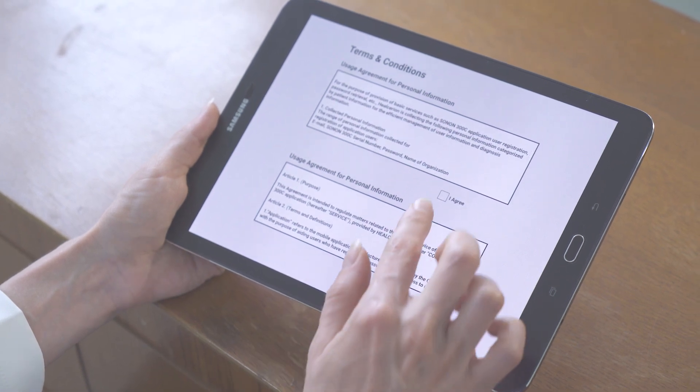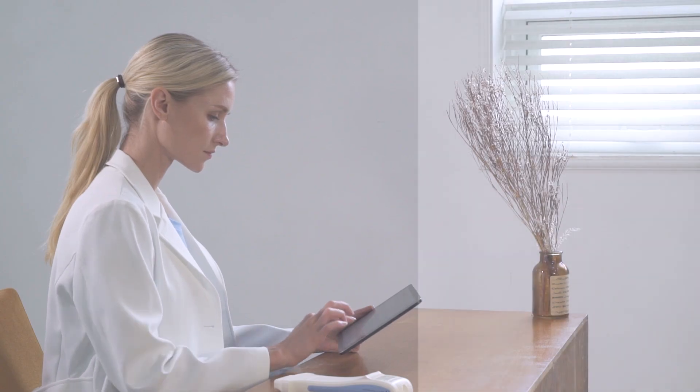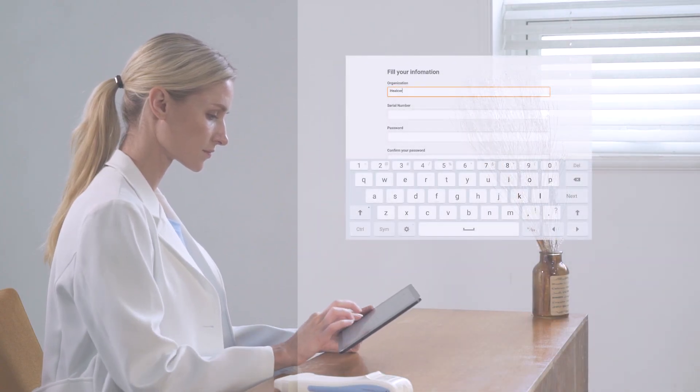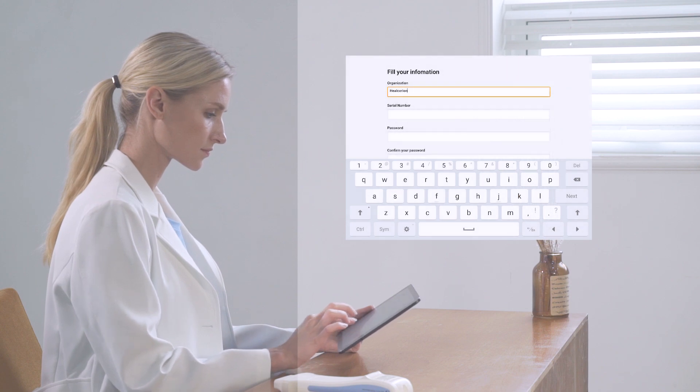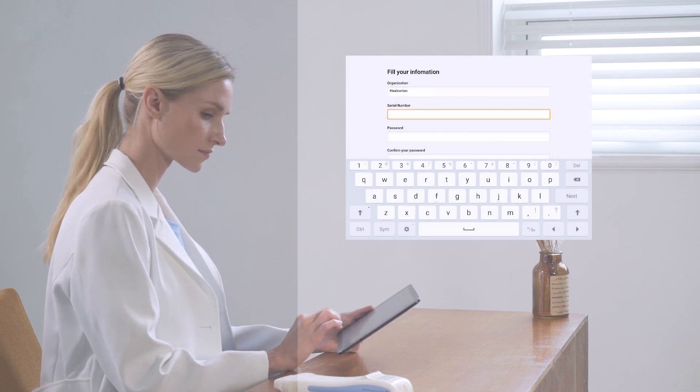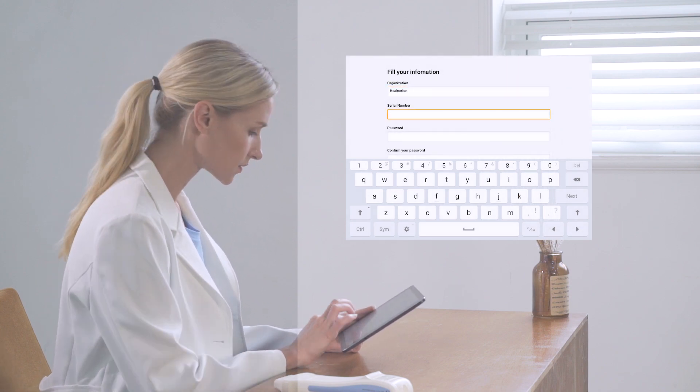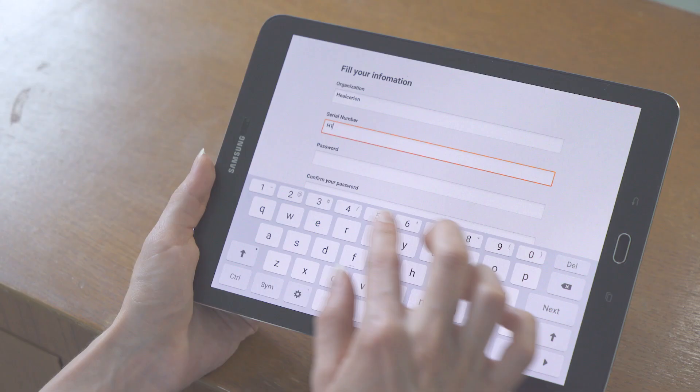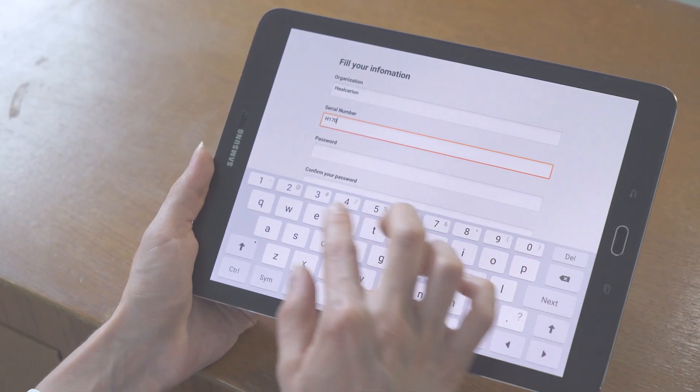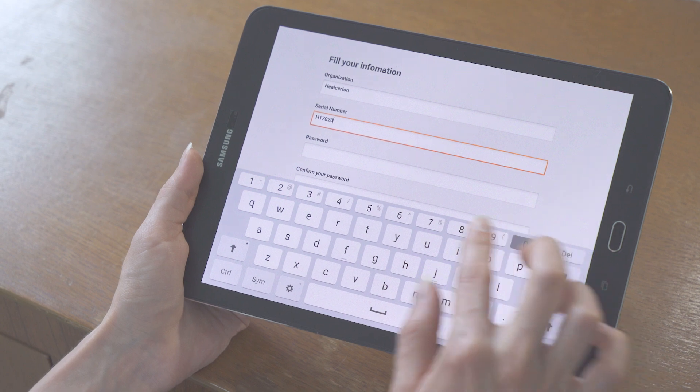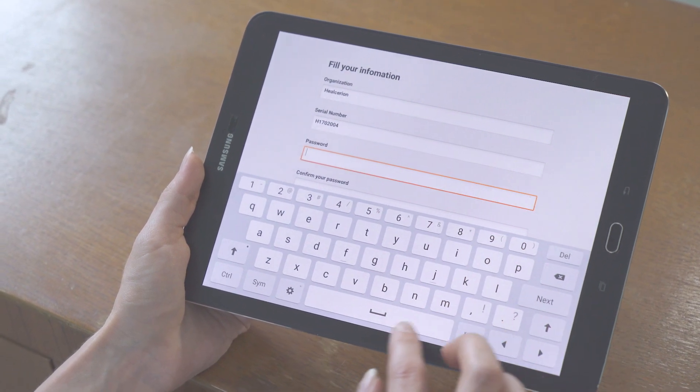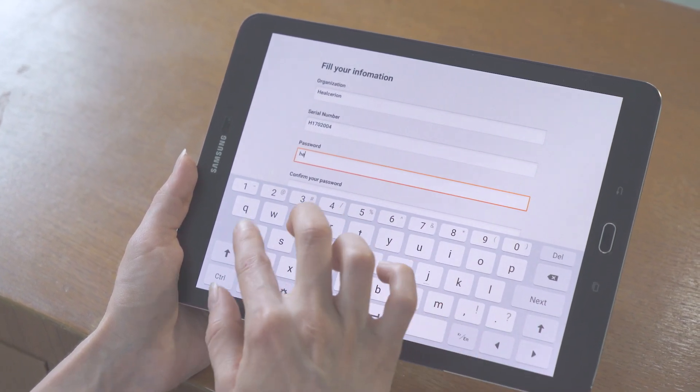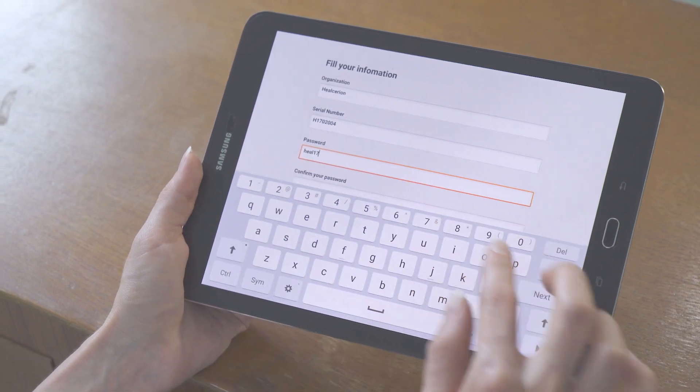Then, agree to the terms and conditions, then fill in the required information for registration of the device. The password on the app is different with the Wi-Fi password.